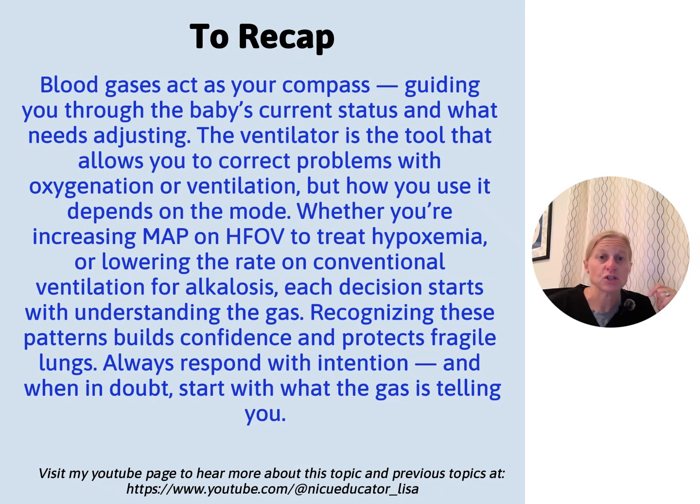You need extra high MAP often to stabilize your alveoli. On the jet, your MAP may actually be lower than it was on a conventional ventilator because it's maintaining the airway pressure and reducing the risk of barotrauma. And that decreasing the risk of barotrauma may also help with brain protection. All of these little patterns build confidence when we respond with intention. And when we think about what could the next step be, it helps us be better, more prepared nurses.